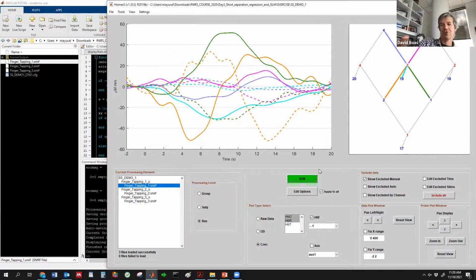You have a large probe, right? And so you could do the exact same thing with a larger probe and it may perform perfectly well. Okay, thanks. I do worry though that if your smallest separation is 30 millimeters, I would try to get short separation measurements in there. Certainly you could get the short separation channels in.